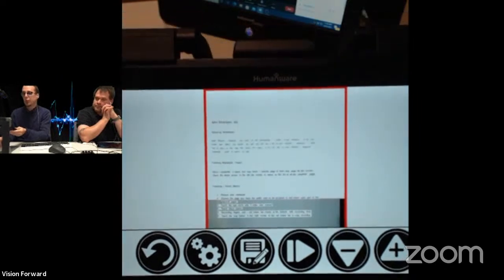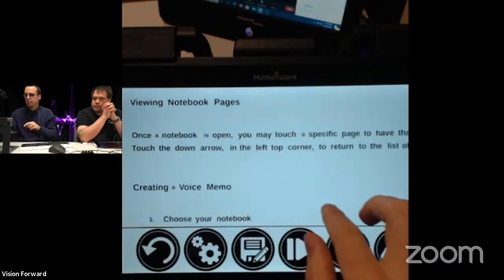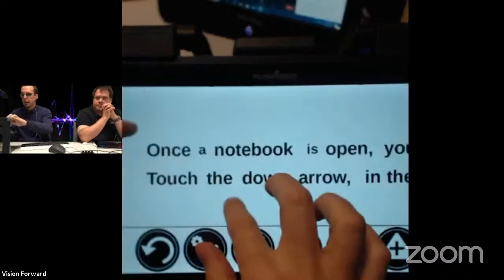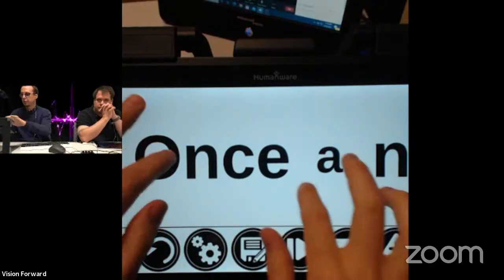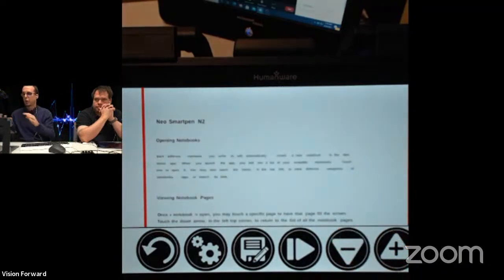Now, one thing that we can do, now that this image has been processed, is actually just read it ourselves. And the benefit to this is that we're not actually reading the physical text anymore. We're reading a computer text, which, if the OCR was successful, should be the same as the printed text. And with computer text, it doesn't matter how large you make it, it will still retain its very sharp edges, good clarity, good contrast. So if we wanted, we could read it ourselves, but because the computer knows what the words are, it can also read them to us.